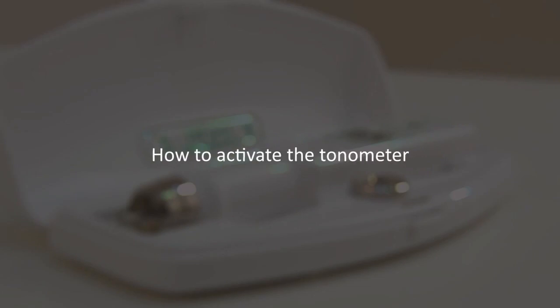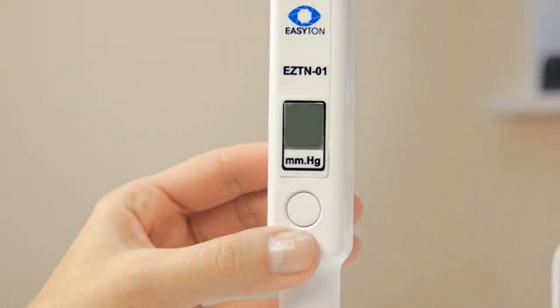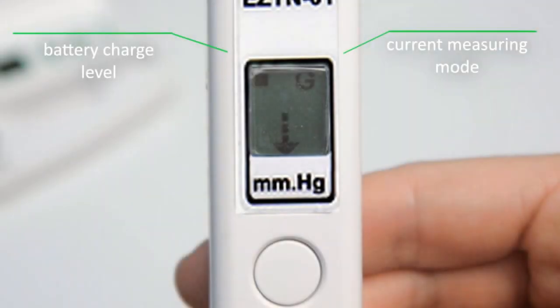How to activate the tonometer: shortly press the ON-OFF button to switch the tonometer on. When activated, the tonometer makes a beep and displays a moving arrow on its display, which is a signal of its readiness for measuring. The G or M symbol in the top right corner of the display stands for the current measuring mode.